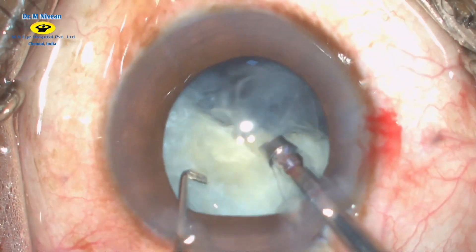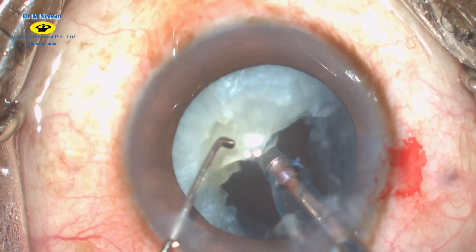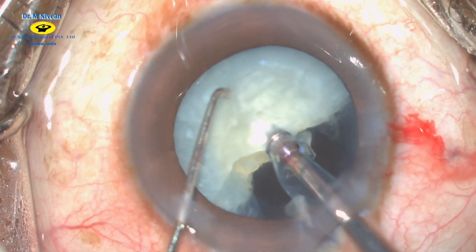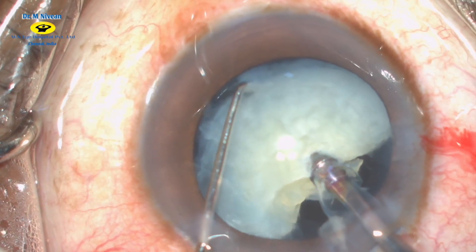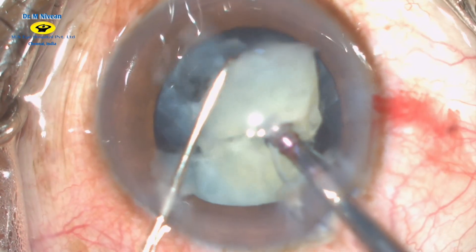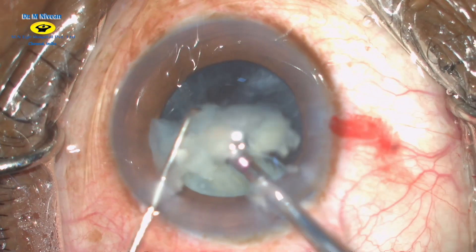The second half of the nucleus is gently rotated. The probe is then buried into the nucleus and, as you can see, the nucleus slips as there is no cortex beneath, making it very mobile. The terminal chop is therefore initiated from the equator of the nucleus and it is chopped into multiple small pieces and emulsified.